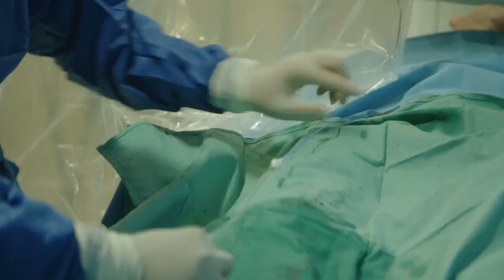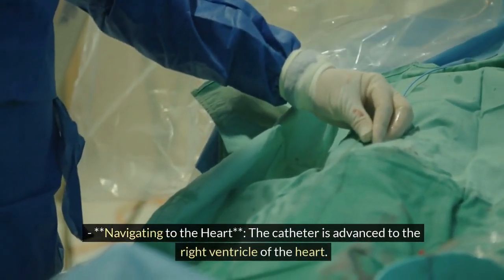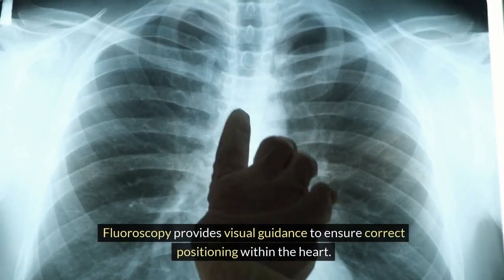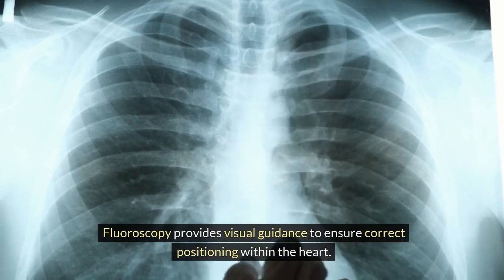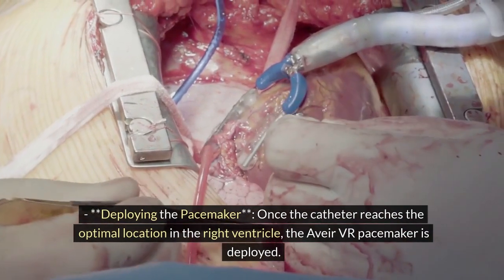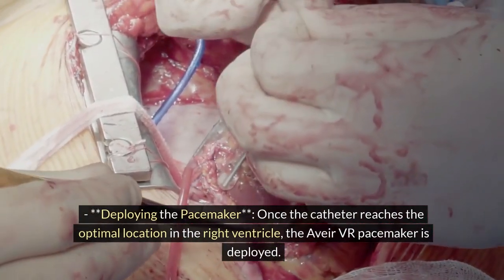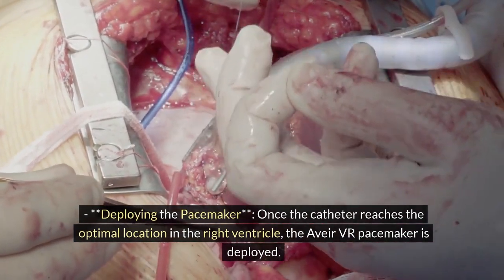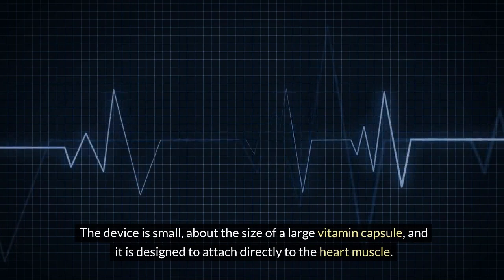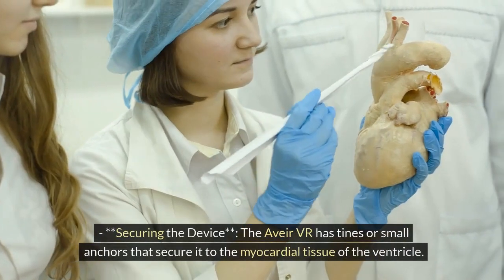Step 3: Device placement. Navigating to the heart: the catheter is advanced to the right ventricle of the heart, and fluoroscopy provides visual guidance to ensure correct positioning within the heart. Deploying the pacemaker: once the catheter reaches the optimal location in the right ventricle, the Avia VR pacemaker is deployed. The device is small, about the size of a large vitamin capsule, and is designed to attach directly to the heart muscle.